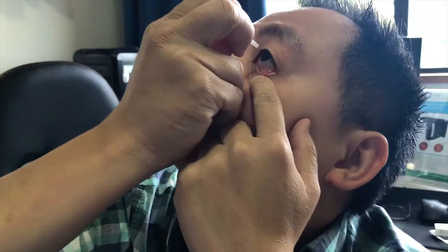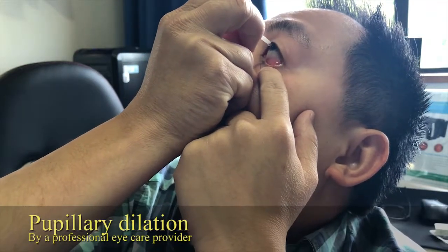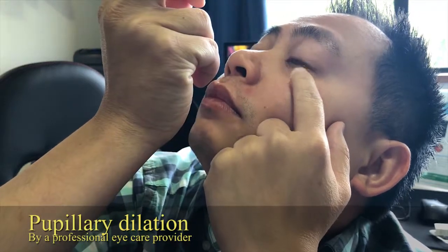They allow us to do a very basic retina examination, just like how we do a BIO. Just like any other retina examination, it is vital to have a good dilated pupil, and to achieve that we usually use dilating eye drops like tropicamide. The advantage of tropicamide is that it is shorter acting compared to longer acting agents like cyclopentolate or atropine, which could dilate your eyes for more than a week.